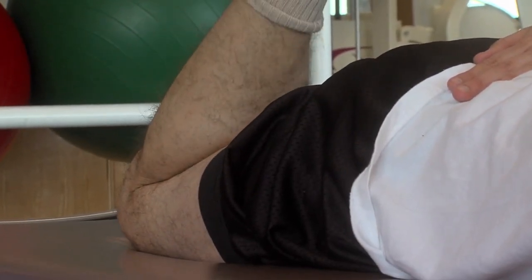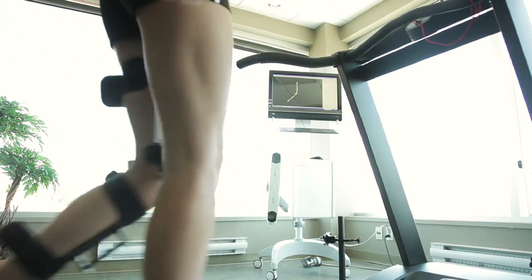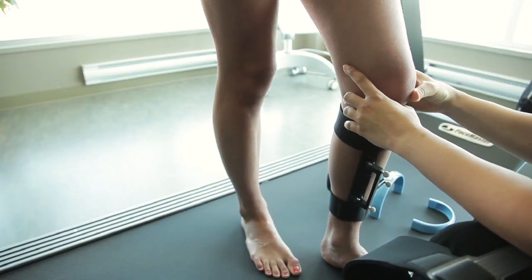truly improve their function. The KneeKG machine, I think, is going to give us a way to objectively document patients' performances and understand ways that we can specifically make them better and allow them to continue to function. I would think this device will allow me to be really specific to understand what's causing their pain, perhaps to tailor the treatment plan that I'm using with them to make it much more specific, and then to document that what I'm doing in fact is improving their function.